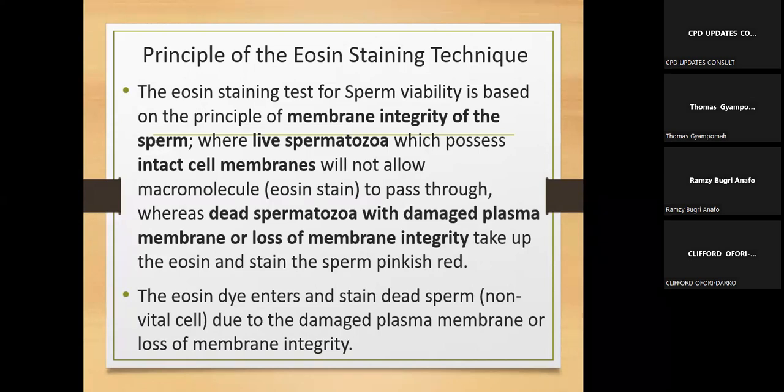If the sample has been taken outside, yet you want to stain it alive, that's supravital staining. And we have vital stains, stains that have the capacity to stain living cells. We use eosin here. However, eosin is not one of the vital stains.